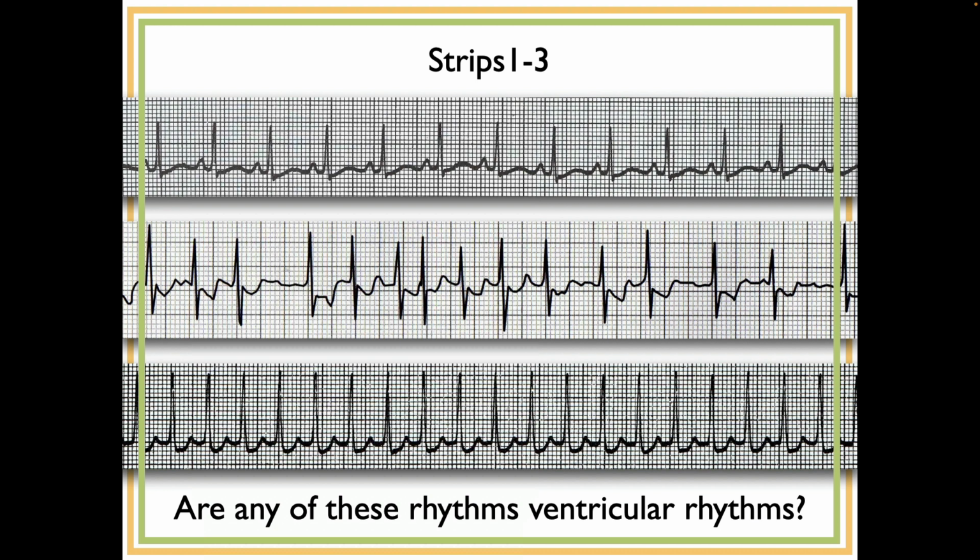And then what about the third one? Is that ventricular or supraventricular? 50-50. We don't have calipers. Well, do your best. And what is it? You're correct. What is SVT? Okay. Oh, and actually, I apologize because you could have used calipers, because if you look on page 25 and 26, I forgot to mention that. You can do it after the fact.